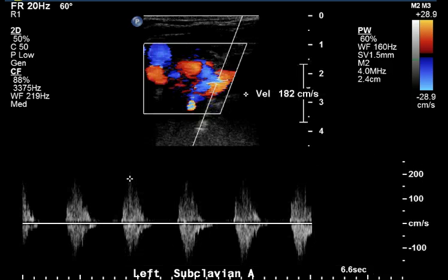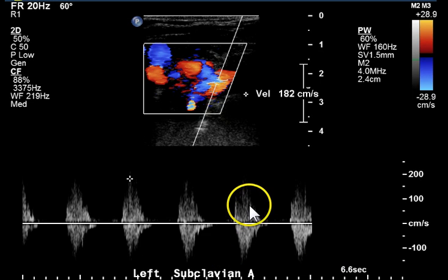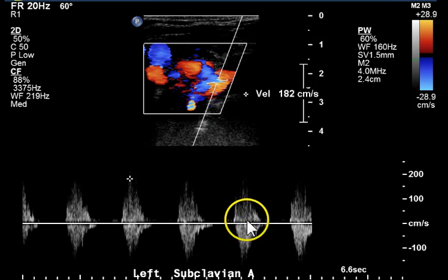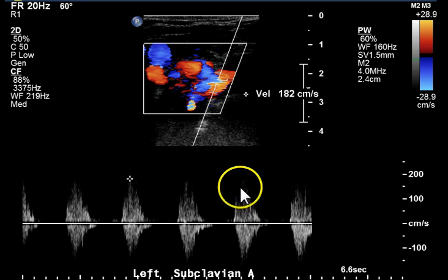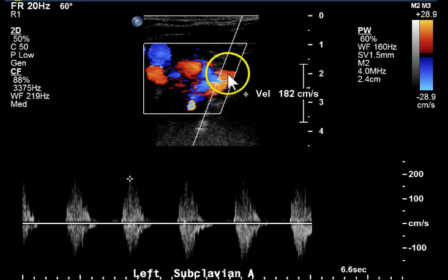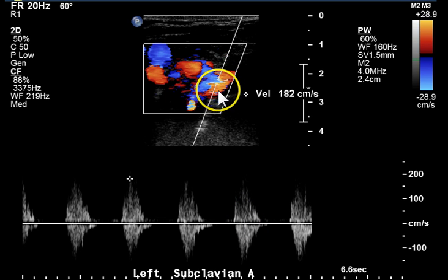Here's another velocity of the subclavian, distal to the stenosis. We get that sawtooth appearance — bidirectional flow indicating turbulence or flow reversal. We can tell that by the blue and red shown in the color portion of this image.